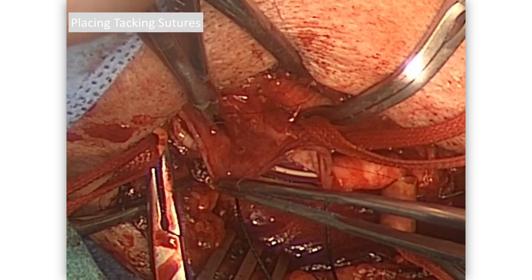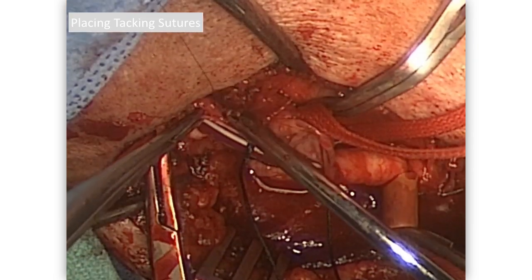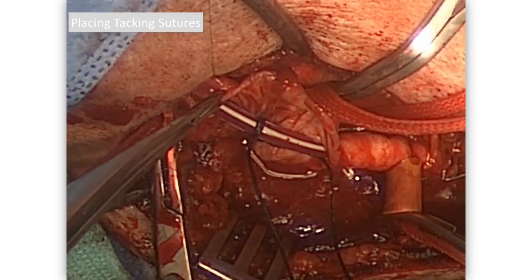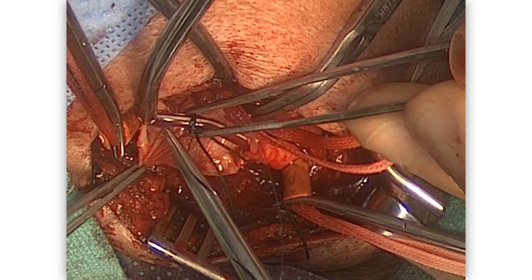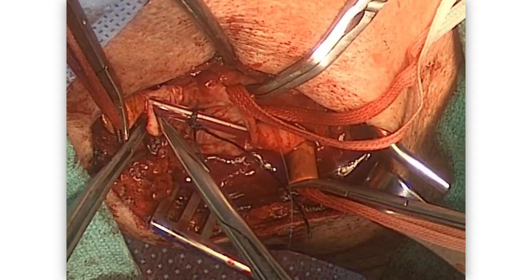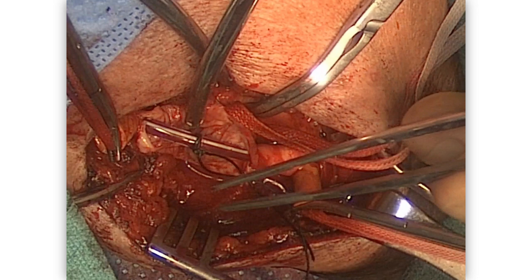Now we're going to put in tacking stitches using 7-0 Prolene. I put one through the intima and one immediately proximal through the endarterectomy, then tie it up on the external aspect. If the arteriotomy is at 12 o'clock, typically we'll do this at 8 o'clock and 4 o'clock. There are a number of ways to check this endpoint and remove any loose debris. The second tacking stitch goes in through the normal intima on the outside — it's a horizontal mattress — right at the edge of where the endarterectomy finishes, and you tie it up on the outside.